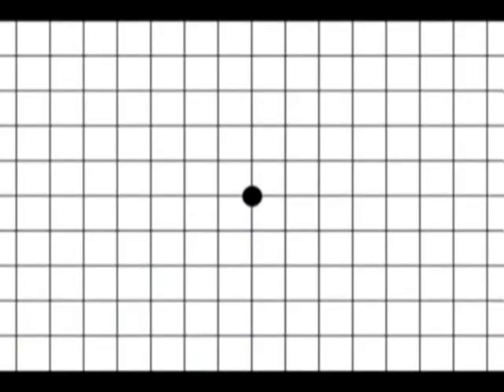If they cannot see part of your face, then use an Amsler grid to check their central vision for distortion and scotoma. Patients may use this grid to monitor their central vision at home. Next, the four quadrants. Again, with one eye covered, ask a patient to look you in the eye and tell you if they can see your finger wiggling in each quadrant. If they cannot see part, then it can be mapped out more carefully with a red hat pin, particularly noticing whether it crosses the horizontal or vertical midline. Finally, for peripheral field, I ask the patient whether they can see a finger wiggle at 90 degrees to each eye, about 5 centimeters temporal.